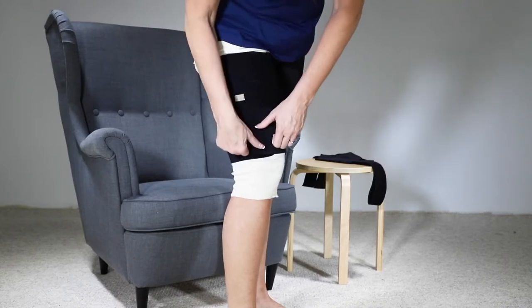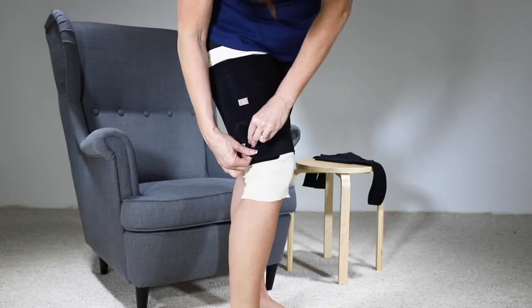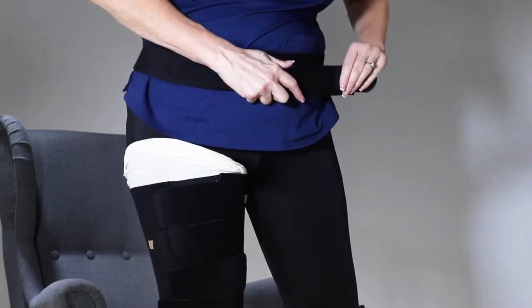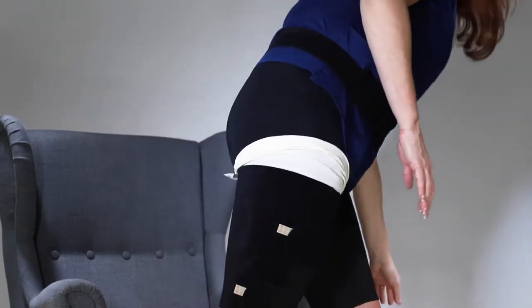Set each strap to the desired compression level. Apply the supplied waist belt. If the belt is too long, feel free to trim the excess.